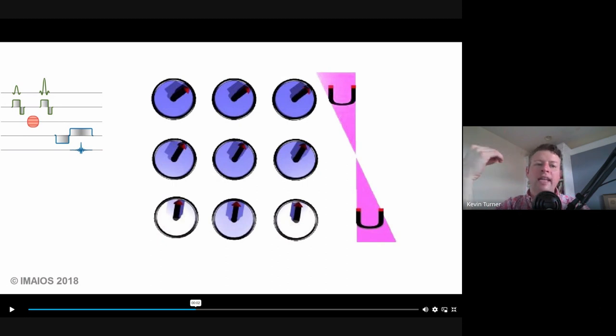So the phase encoding gradient turns on, precessional frequency gets altered, and when precessional frequency got altered, that changed the phase. Now, when I turn the gradient off, all the protons go back to the same precessional frequency, but the difference in where they're pointing stays. The car that went 70 miles an hour a little bit, it stays ahead of the other car because now they're all going the same speed again. So the three cars are now 1, 2, 3, even though they started lined up at 50 miles an hour and they ended up going 50 miles an hour, they're all in different spots from each other.